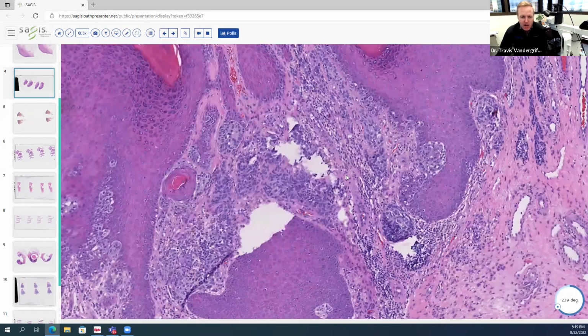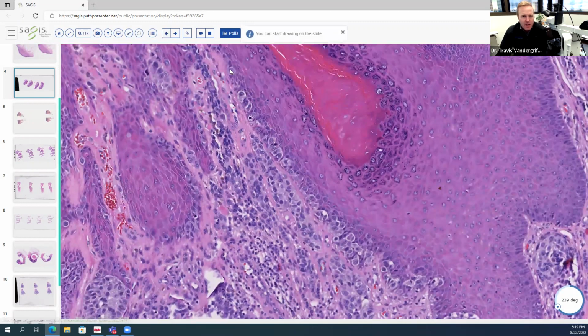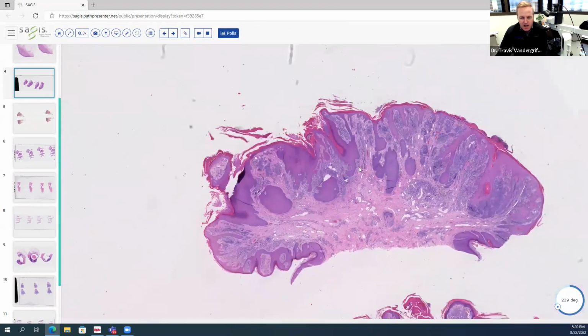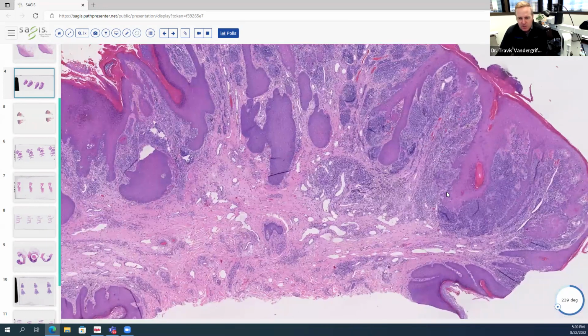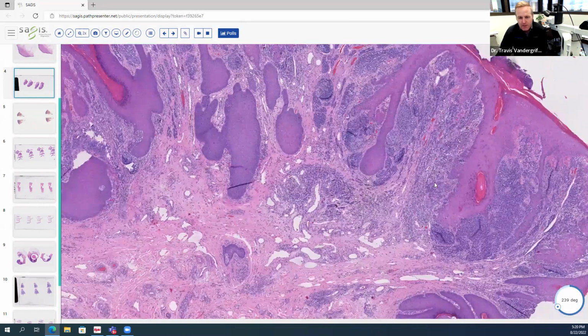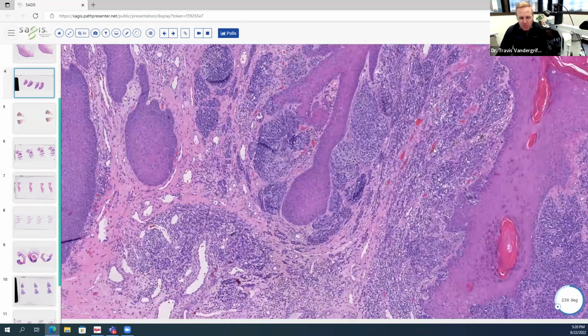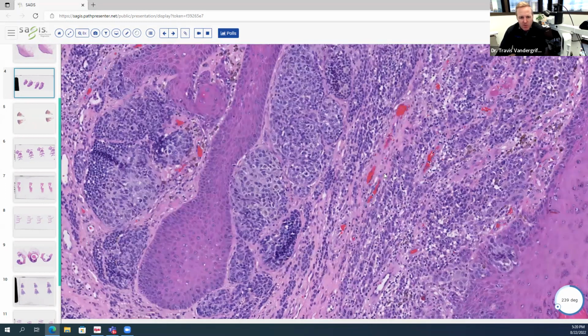If we look at the overlying epidermis, there are a few clues as well. This would be a confluence of single melanocytes along the junction. That's not something you'd expect to see in a nevus either. So while the silhouette gives us a benign impression, our closer inspection reveals some features that are inconsistent with a nevus. So this is a melanoma, and because the silhouette looks benign, we would call this a nevoid melanoma.